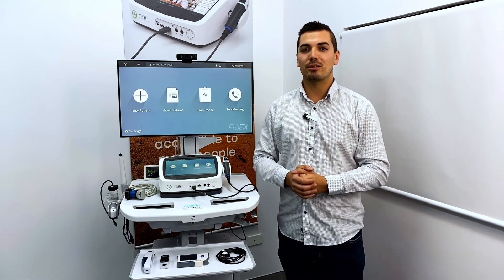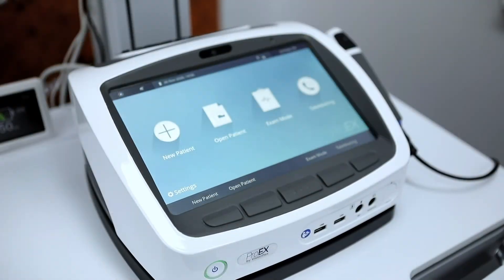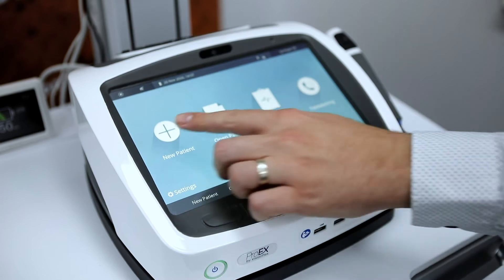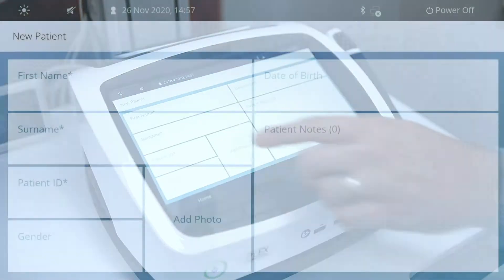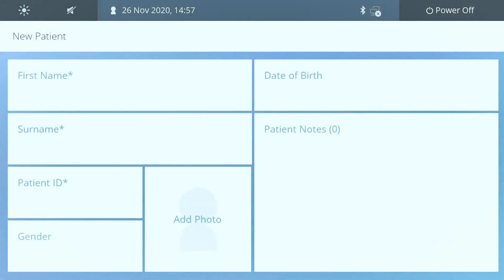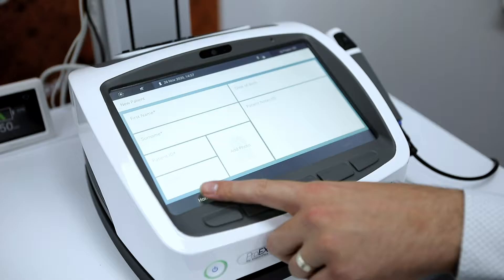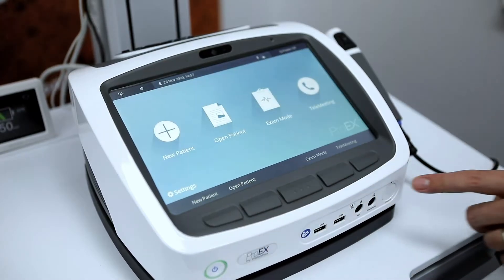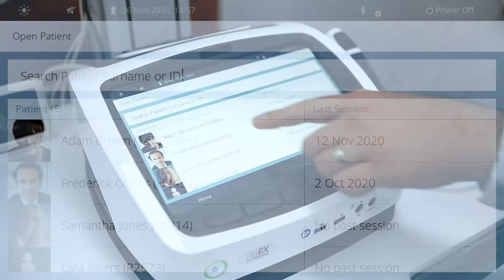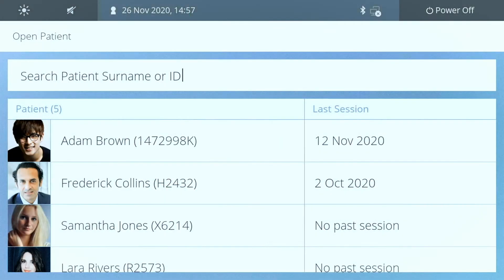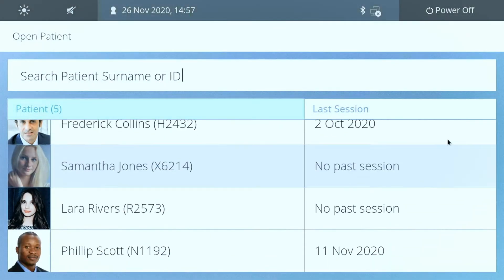Let me talk you through the menu. We have four tiles. Starting from the left side of the screen, we can add a patient on the device with a first name, surname, and unique patient ID. We then have our patient database where we can search for and select a patient and view their session history.